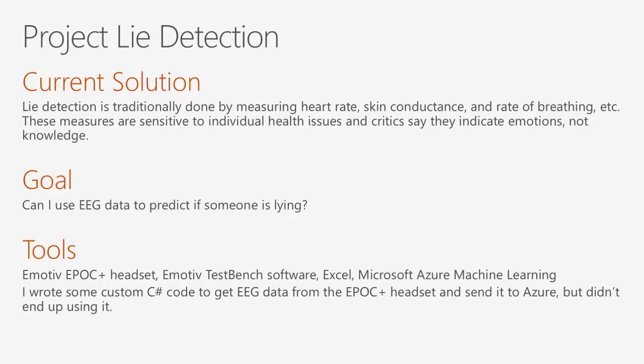There's a lot of critics of polygraphs who complain that it's not really that effective, because it measures your emotional state, how emotional you are, rather than guilt. So if you're really, really nervous, sometimes those things can make a difference. It measures things like your heart rate, galvanic skin response, the sweatiness, rate of breathing, all of these types of things.